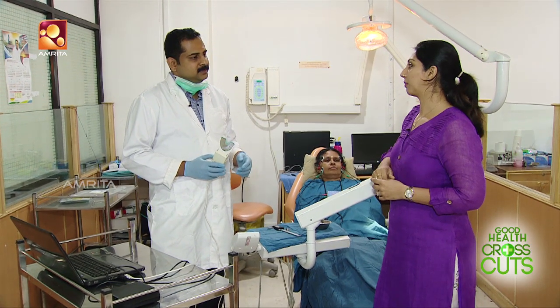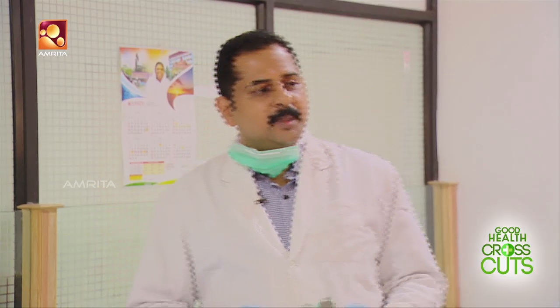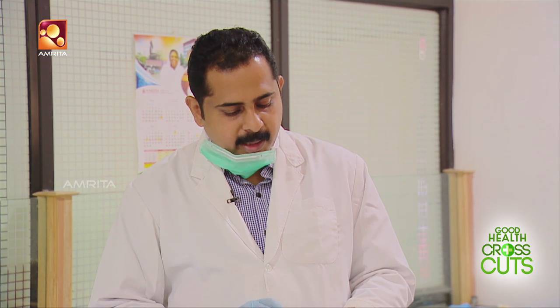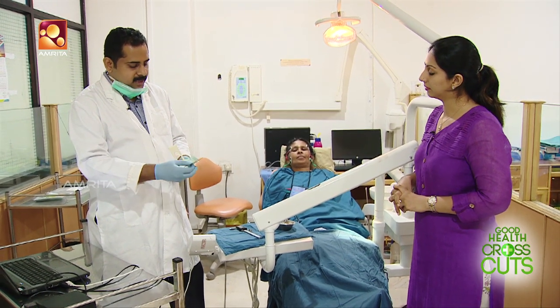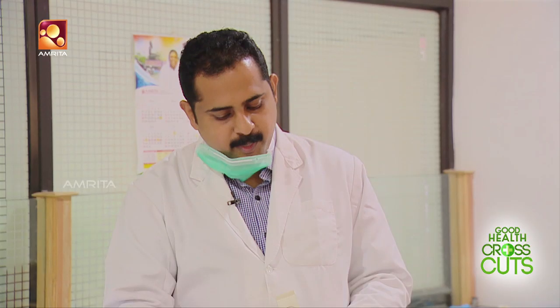This is a digital bite scan. I would like to explain the digital bite scan, the EMG equipment, and the T-scan equipment. This here is a sensor — specifically, a pressure sensor. And this is the patient.